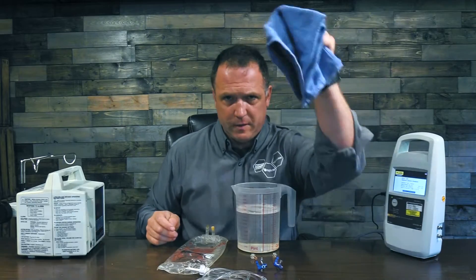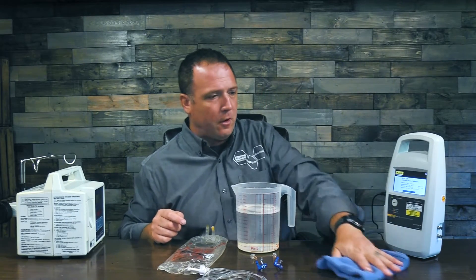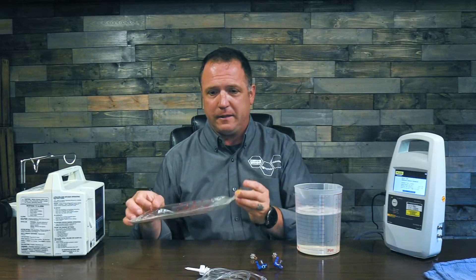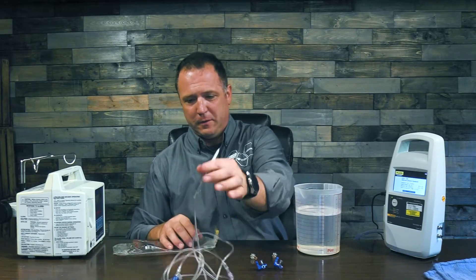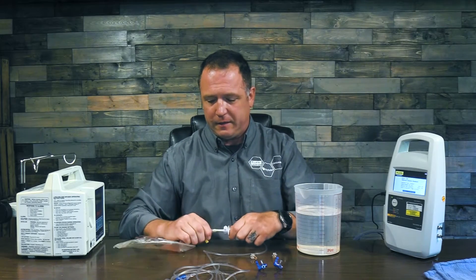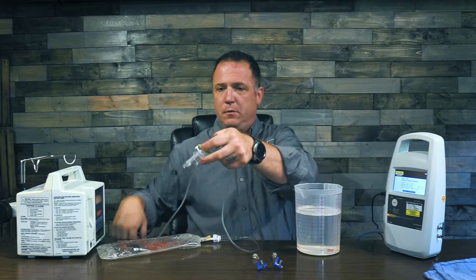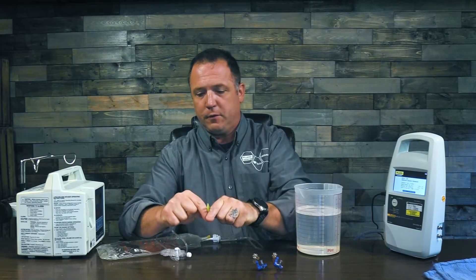Something else you might want is a nice clean rag because you're inevitably going to drip water all over your test bench in this process. Since I've already used this bag, I'm going to connect the test cassette to it before I fill it up so I don't get water all over the floor. I'll go ahead and connect it like so, make sure that my cassette is closed, and put the safety valve closed on it.